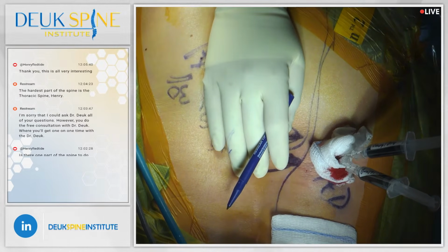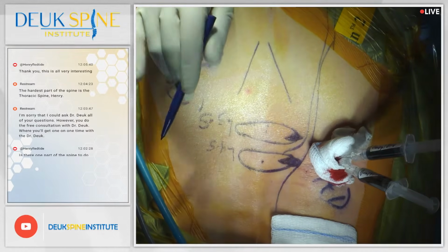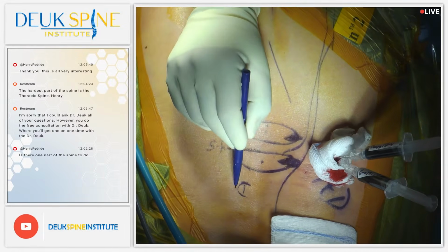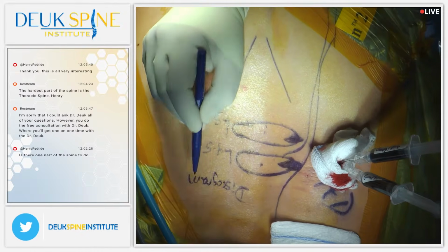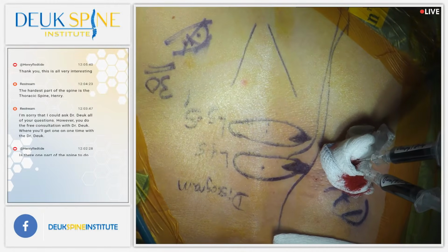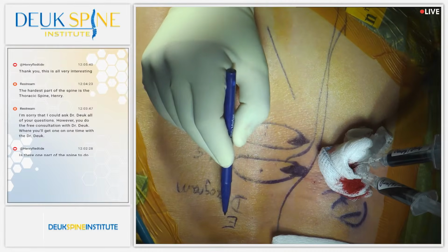Are you having any pain right now? No. All right. The only test in the world that tells a doctor if a disc is the cause of somebody's pain is called a discogram. Okay, discogram. We're going to do a discogram in just a few minutes. It's called an evocative discogram. You can look it up. You're evoking a response.